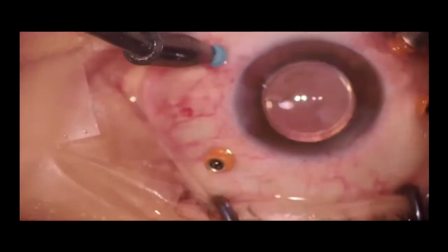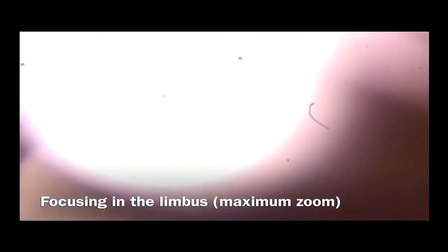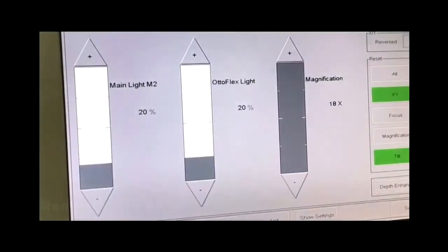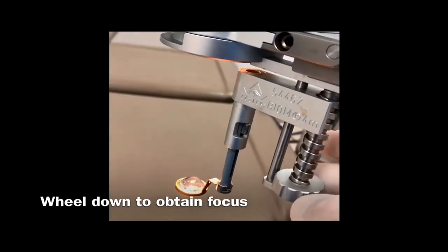After you've done that, then go down and with the maximum zoom, or at least more than the mid zoom, focus on the limbus, and once you focus the limbus, then put the lens into position. After you put the lens into position, then reduce the magnification and just try to get the lens down till you get the focused view.